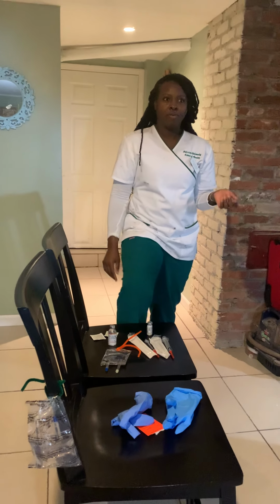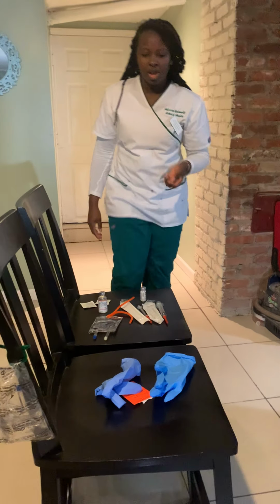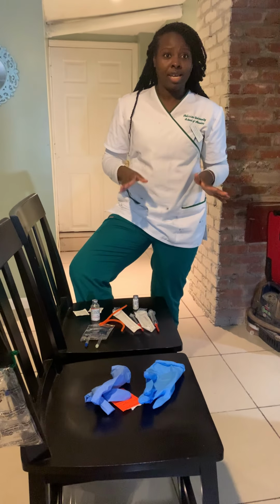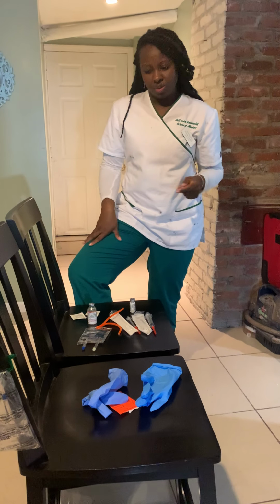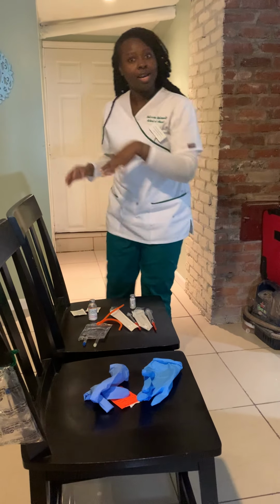For this video, I will be doing IV piggyback medication administration. This first part of the video will be technically done in the medication administration room, and the first thing to do is to perform hand hygiene.